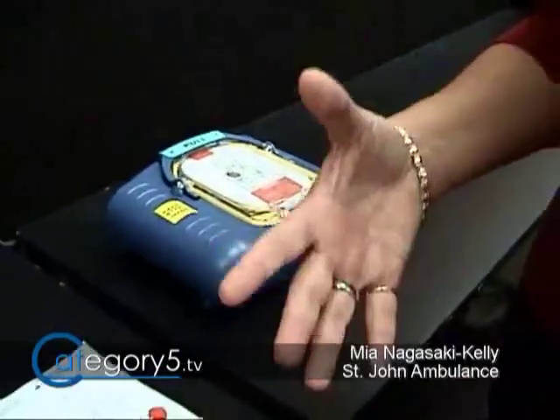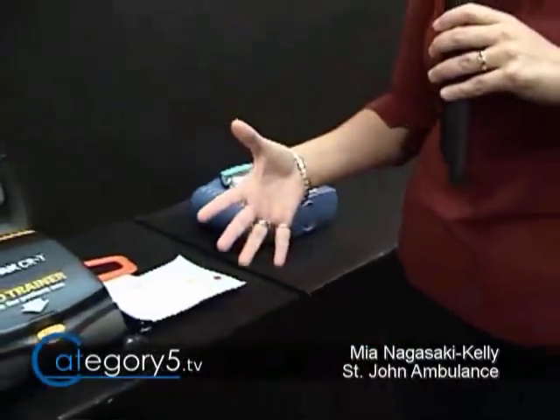Each machine is a little bit different. Turn it on, follow the prompts, and you're good to go. They all shock the casualty.